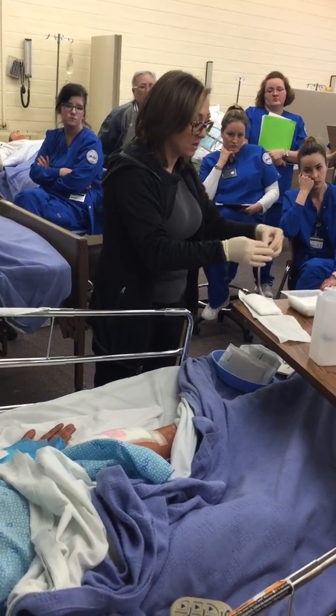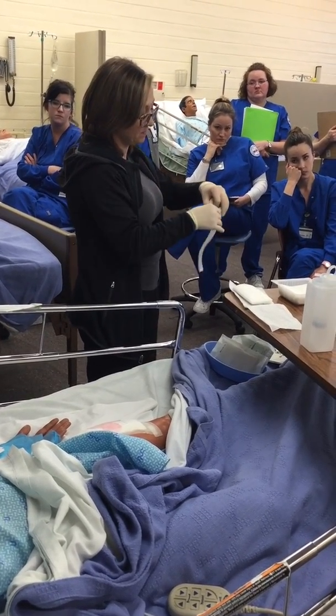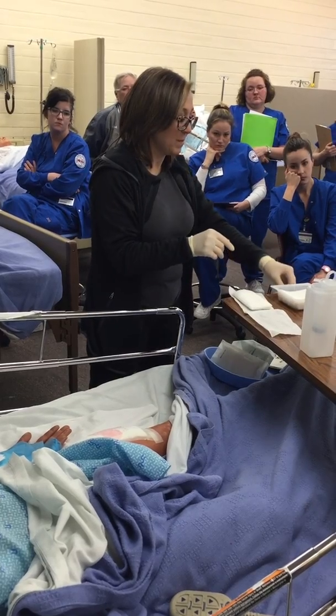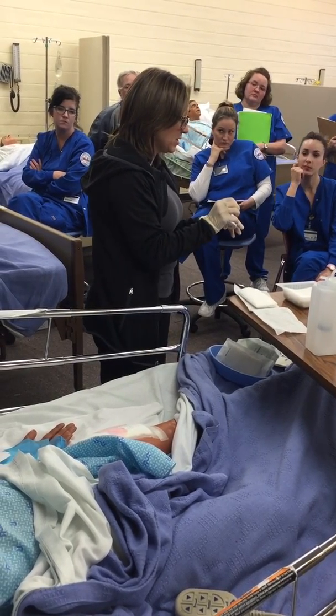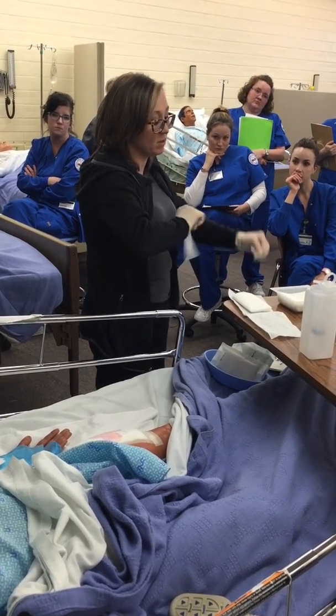Make sure you wipe your tables off with antimicrobials if you use them like this, because who knows what's on the tables. So I have 2 for my sides. I'm going to get 2 for my ends, correct? I'm also going to have a pen with me because I'm going to have to write on the dressing when I'm done.